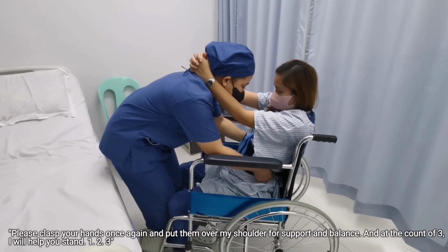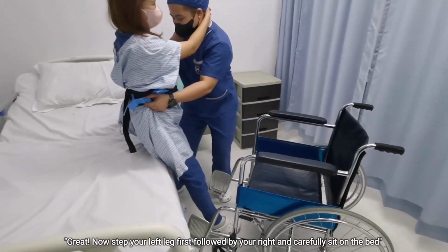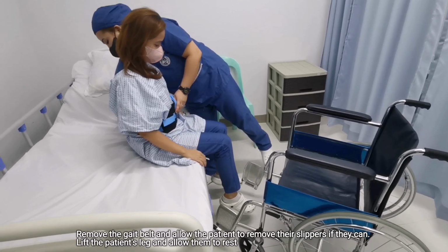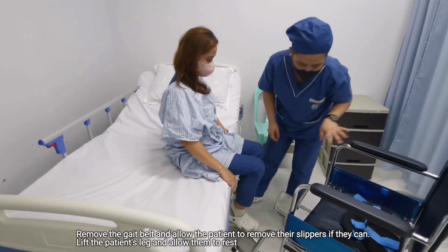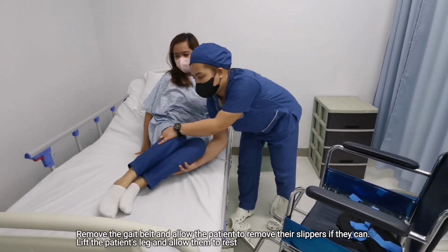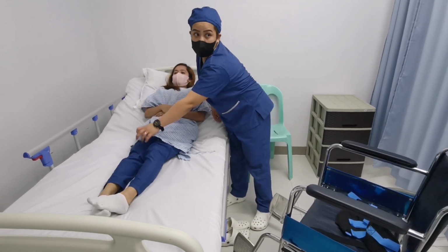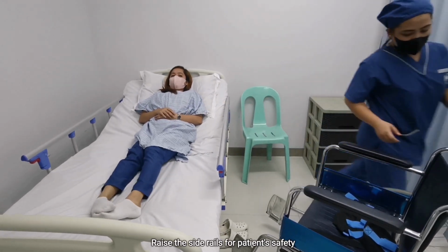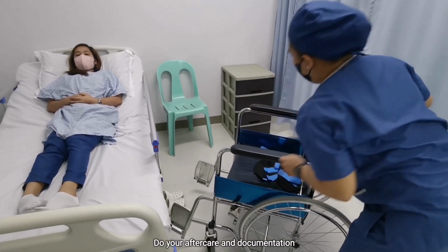1, 2, 3. Great! Now step your left leg first, followed by your right, and carefully sit on the bed. Remove the gait belt and allow the patient to remove their slippers if they can. Lift the patient's leg and allow them to rest. Raise the side rails for patient safety. Do your aftercare and documentation.